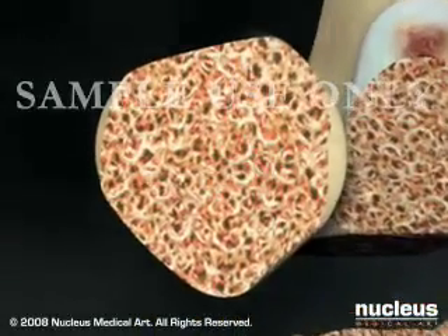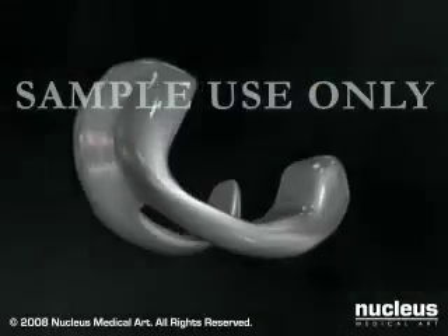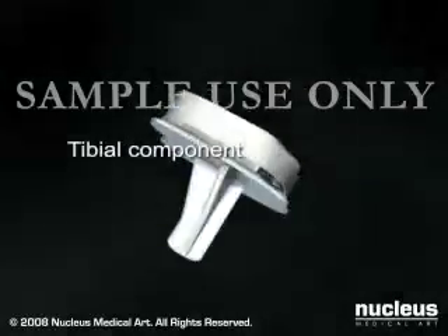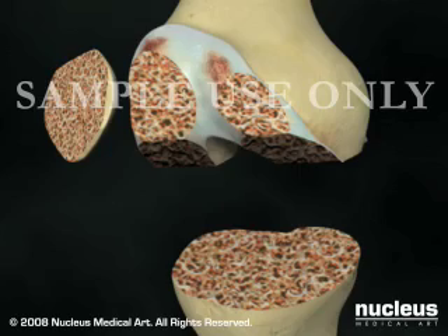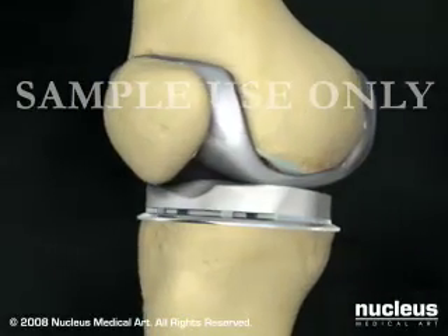Your surgeon will then prepare the remaining bone to receive your new prosthetic knee. This generally consists of a femoral, a tibial, and a patellar component. Once the ends of the bones are prepared, your surgeon will cement the new prostheses into position.